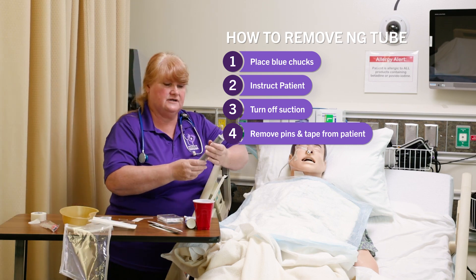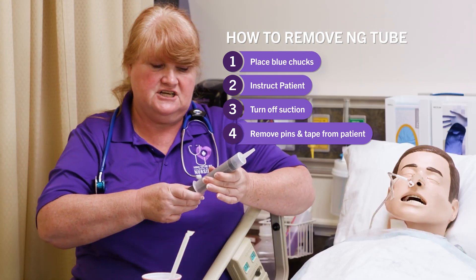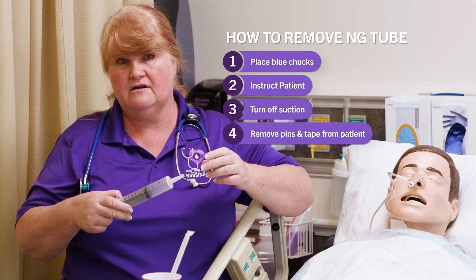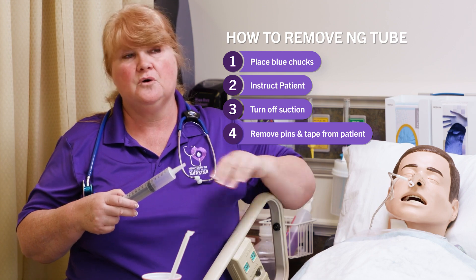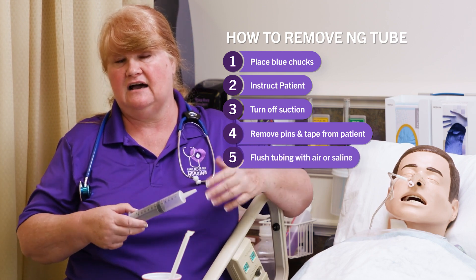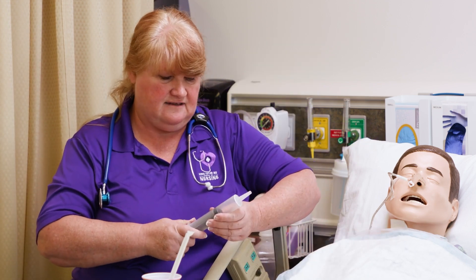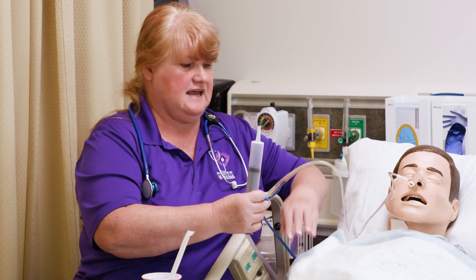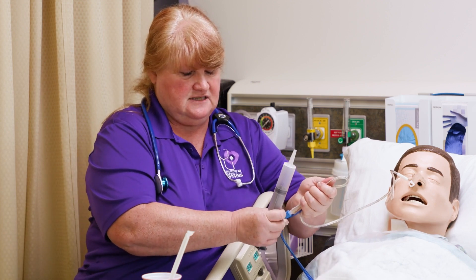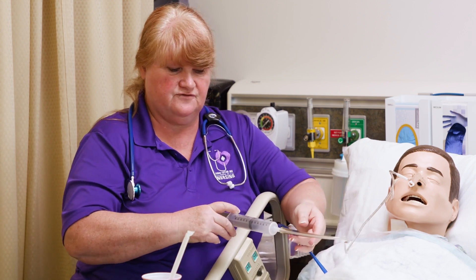You can do this one of two ways: you can flush it with 30 to 50cc of air to make sure the tube is cleaned out, or you can flush it with 10 to 15cc of normal saline or tap water. Either way is fine. We just want to make sure that as it comes up, it doesn't sting the patient with the gastric contents. So we're just going to flush it.